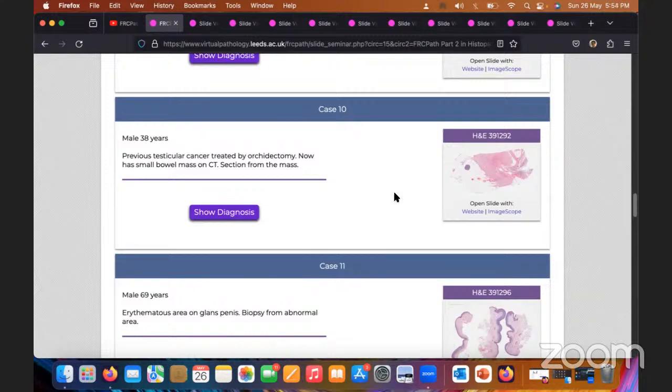Okay, so that is there. And one another approach: if you are having multiple foci, all very close to each other, you can say that various foci have been identified, and the largest among them is this, even though there are other small foci measuring this. So you can mention all the other foci and their dimensions, and you can keep the core data elements pertaining to the largest foci, whether they are angioinvasive, showing lymphatic invasion, and all that. So the core data elements can be concentrated on the largest T size.